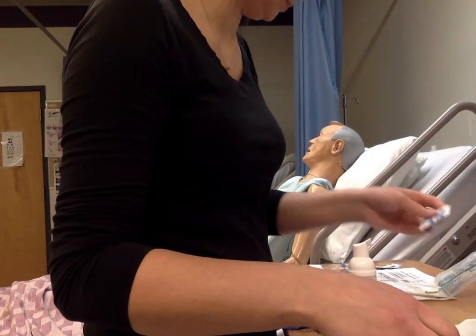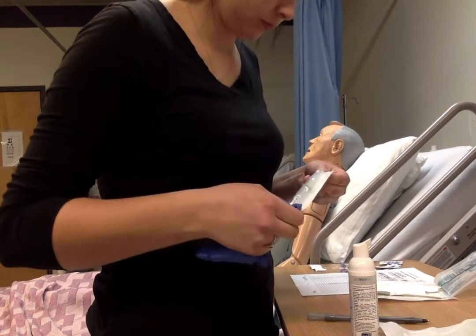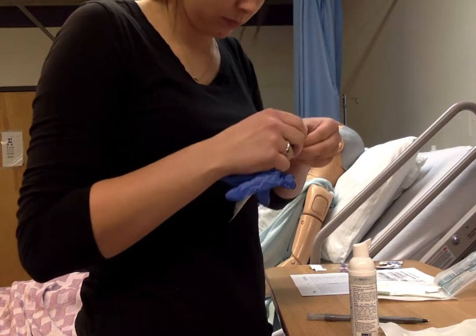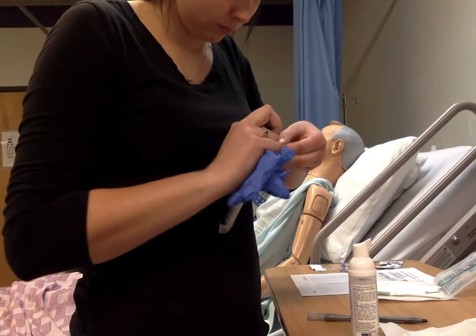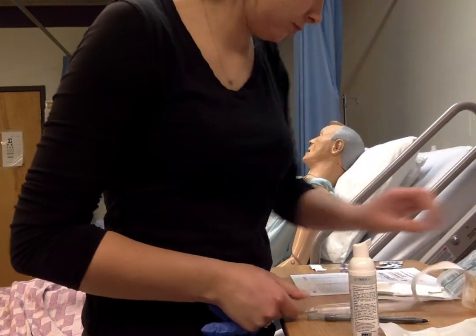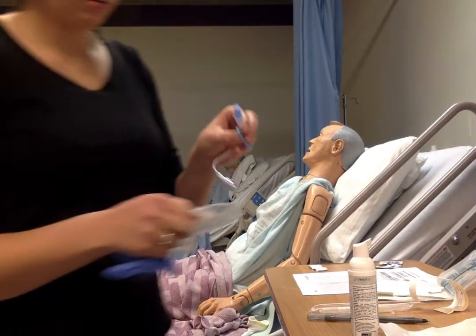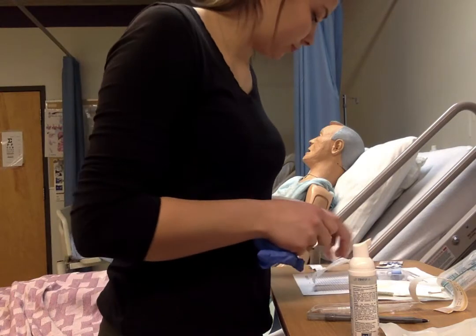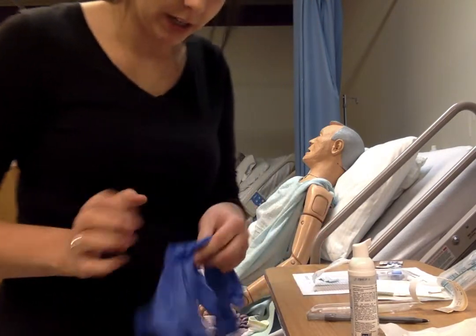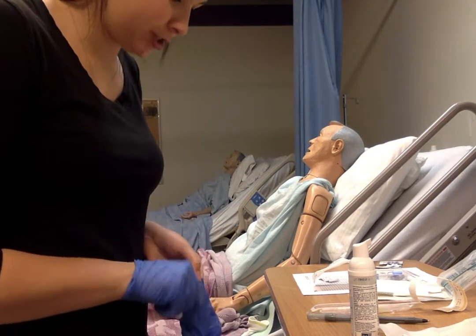Two. All right, and I will put some gloves on. So that area should be dry now.